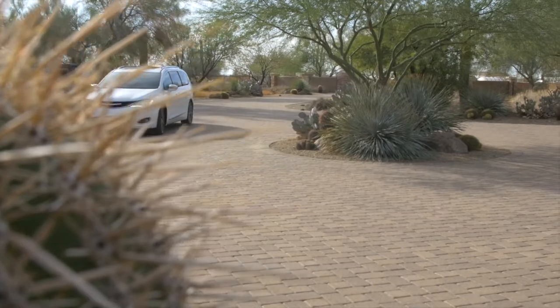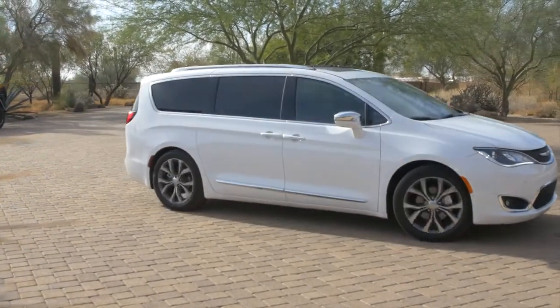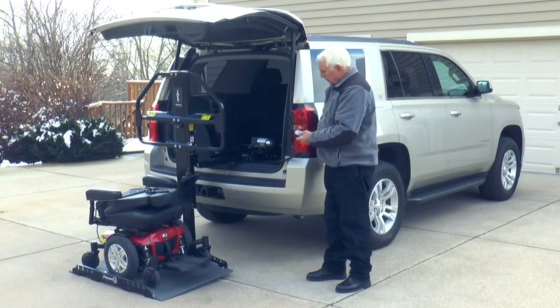Your local Bruno authorized dealer can quickly install the Joey. And if you purchase a new applicable vehicle in the future, it's likely that the Joey can be reinstalled.